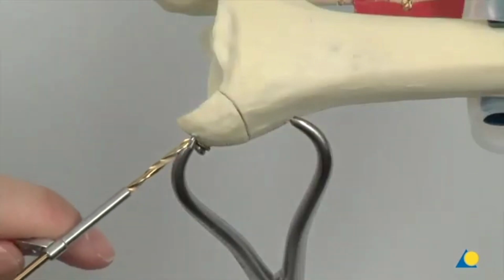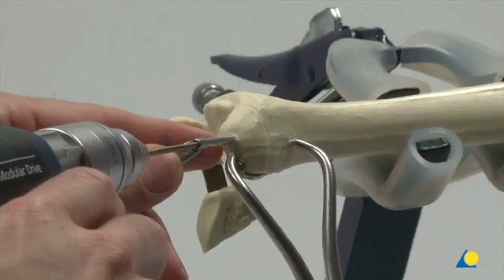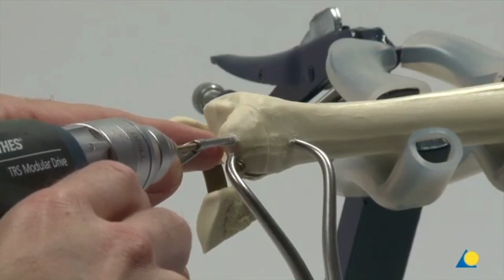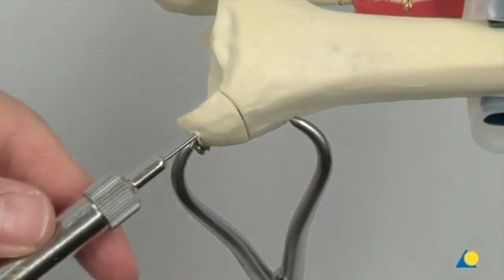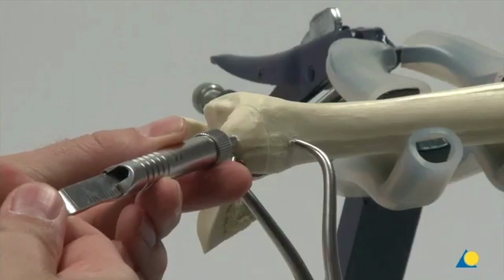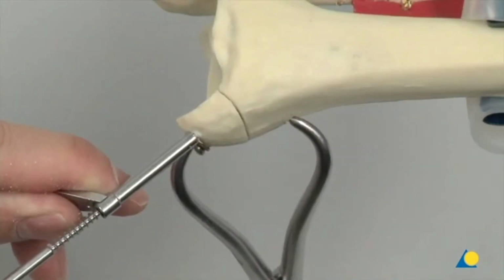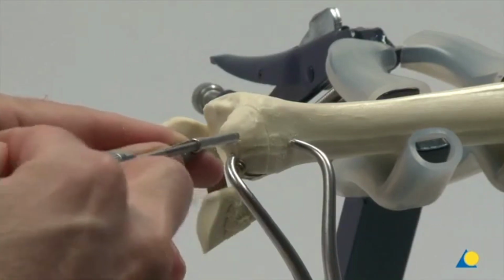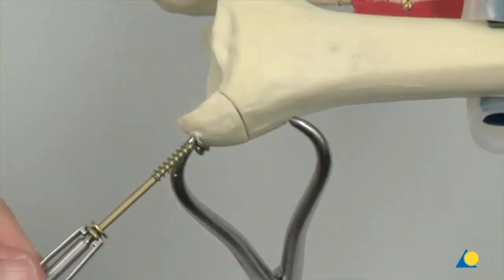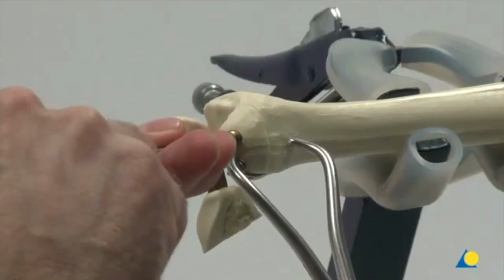The hole for the second screw is drilled with the 2.5 mm drill bit in the same position as the channel of the previously removed K-wire. The required length of the screw is measured with the depth gauge. The 4.0 mm cancellous tap with appropriate sleeve is used to create the threads. The second 4.0 mm cancellous screw is inserted in the same manner as the first one.